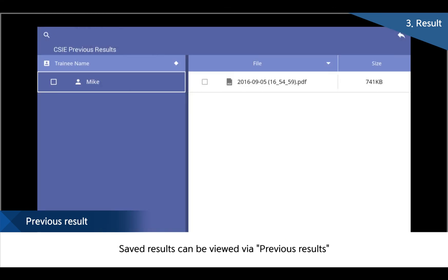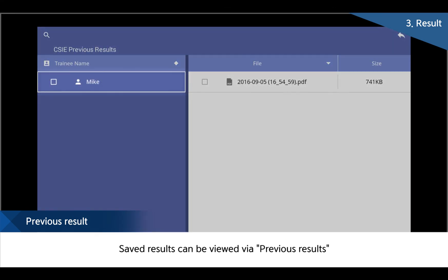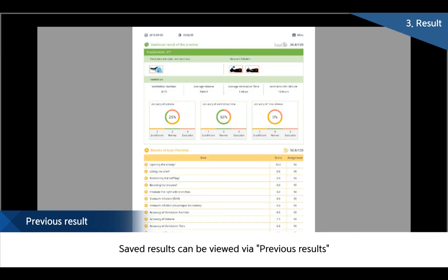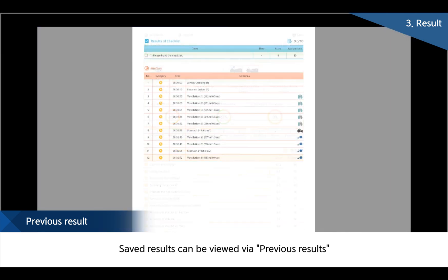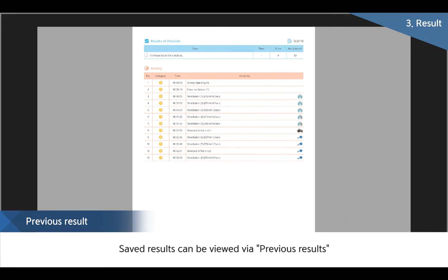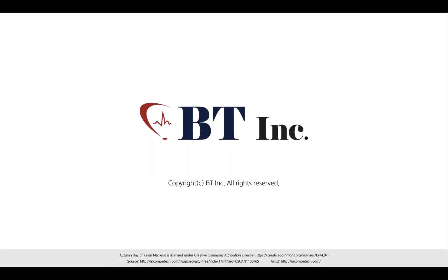BT aims at increasing the quality of education with our unique feedback and self-practice system, which can enable trainees to check all the details and results in real time. BT provides products with best quality for next-level education with our own technology.